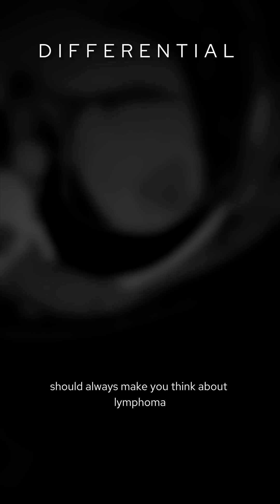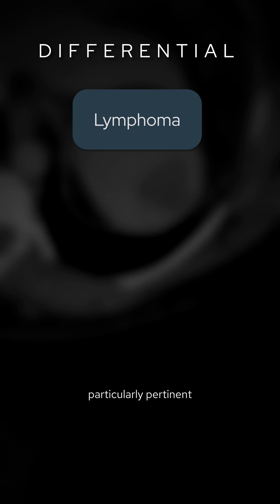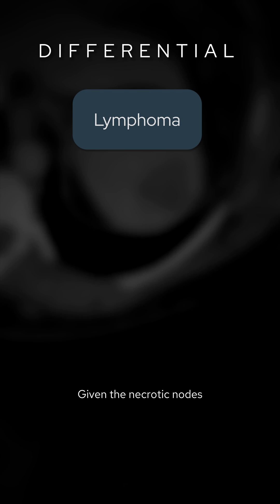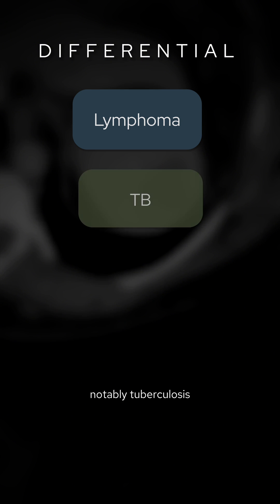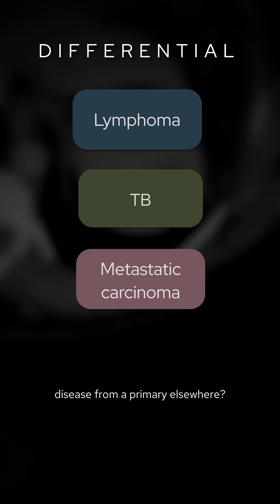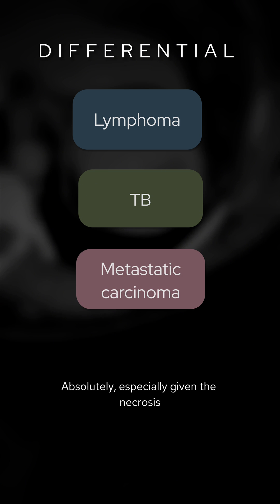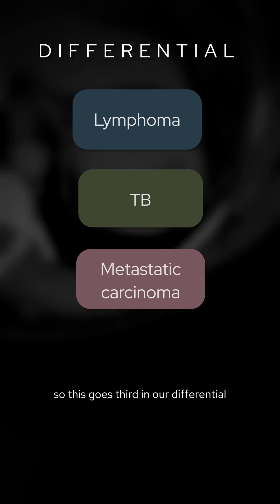So what is the differential in this case? Multiple lymph nodes should always make you think about lymphoma, particularly pertinent given the lesion within the spleen. Given the necrotic nodes, depending on the clinical situation, clinical correlation is advised — we need to consider infection, notably tuberculosis. Could the nodes represent metastatic disease from a primary elsewhere? Absolutely, especially given the necrosis. So this goes third in our differential.